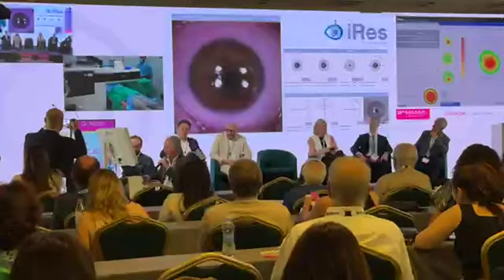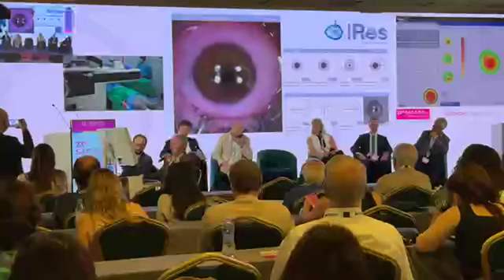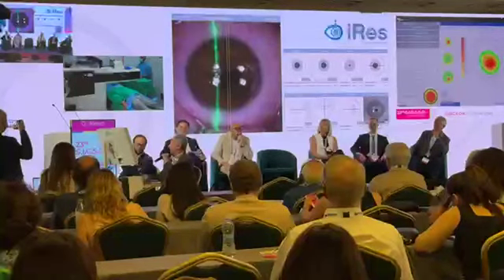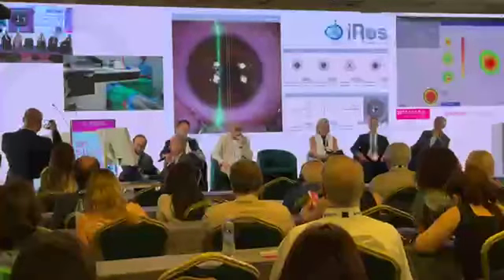Okay, the patient, yes. I control now the laser. Now the procedure is fully automatic. So the distance from the laser, the centering and some other things are all automated.